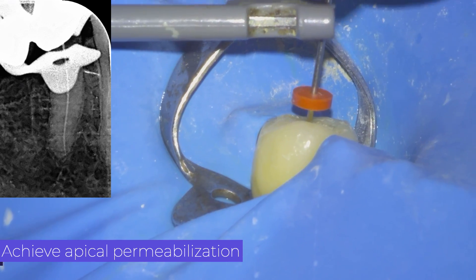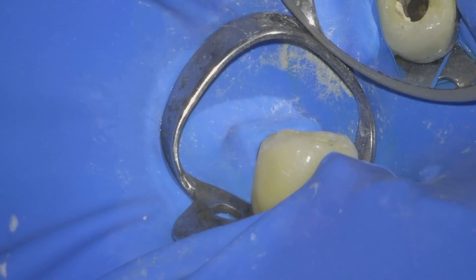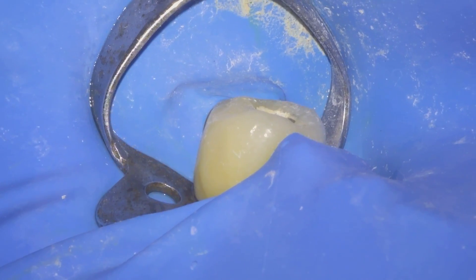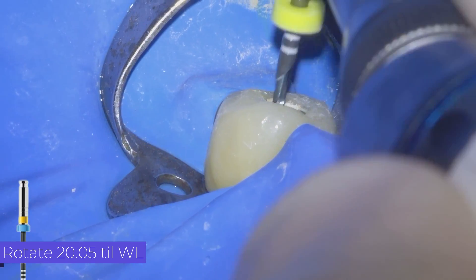In this case patency is performed with a 15 file. Now we continue with the sequence of the Rotate system, working with the 20 file at 5% taper with brushing movements.